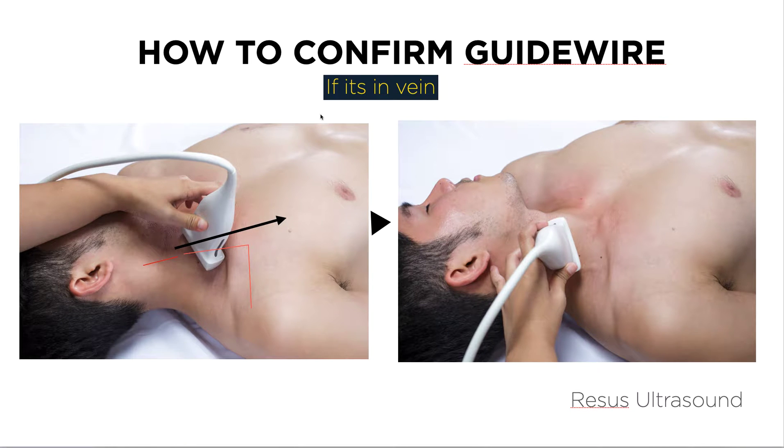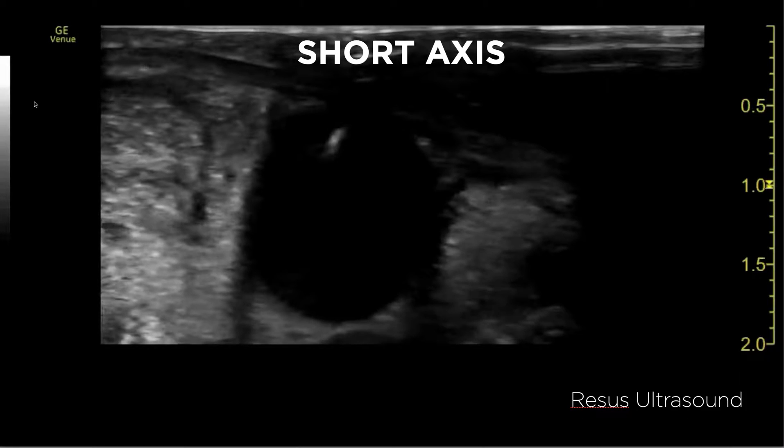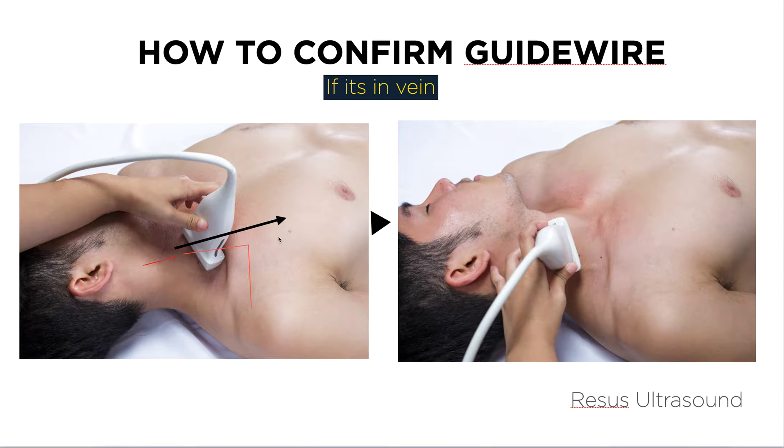Happy new year everyone. Today I have a great clip from our residents on how you can actually see the wire in the jugular vein — whether it's going down to the right atrium or if it's diverting to the arms or head. Basically, there are two views you can do. The first one I'd like to show is pretty great because you can see whether the wire is going down or not.